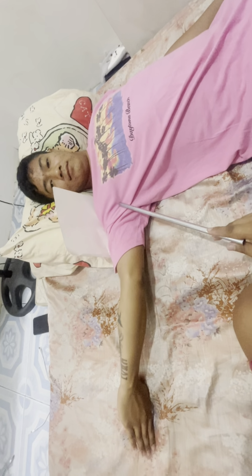Next projection is infero-superior axial projection, Rafert et al. modification, directed 15 degrees. Same lang pero yung kanyang kamay is naka-rotate. It is to show the Hill-Sachs compression fracture on the posterolateral humeral head. Naka-rotate po ang kanyang kamay and then same pa din po.